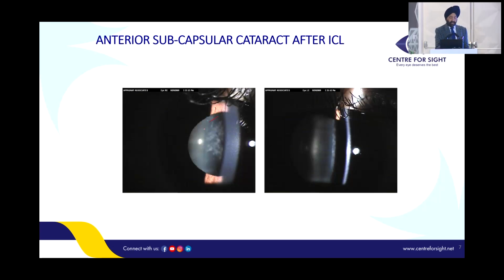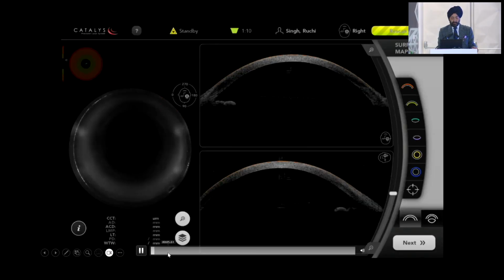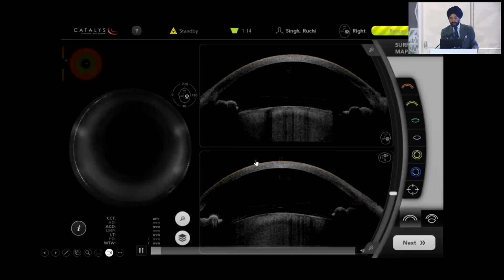This is a typical cataract that develops very early if you are leaving behind viscoelastic just below the lens, because it's very difficult to go below the lens and aspirate it out. So you use the hole for pushing fluid so that the central portion is clear, or using it to aspirate. This is a case of cataract. You can see we are using a femtolaser to take it out.